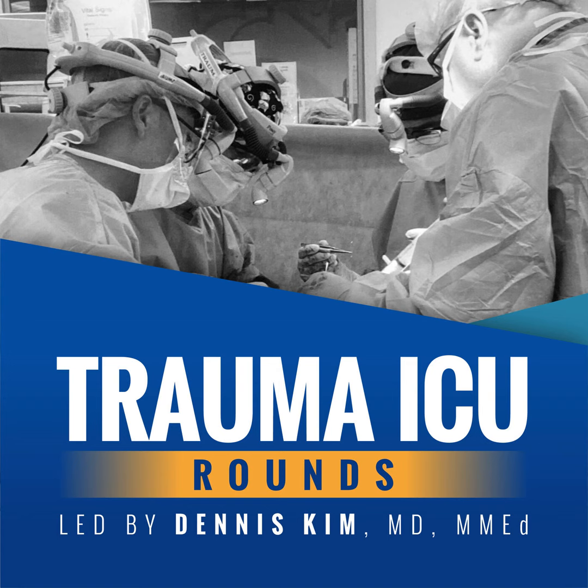Number 2, or in the second place, we have patients who have either impending or established acute respiratory failure. And so whether it's newly diagnosed acute hypoxemic respiratory failure or acute hypercapnic respiratory failure in the setting of a COPD exacerbation that we've attempted non-invasive ventilation on, yet patients remain refractory, as manifested by increased work of breathing or an ineffective breathing pattern. These are certainly scenarios where patients should be intubated and placed on the ventilator.